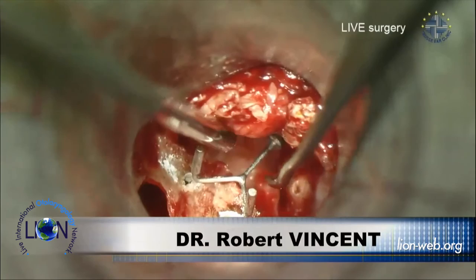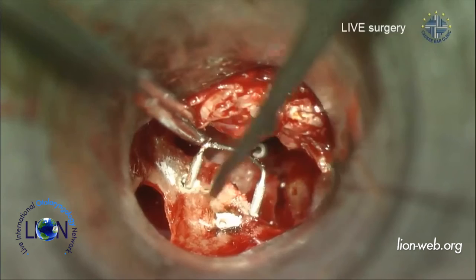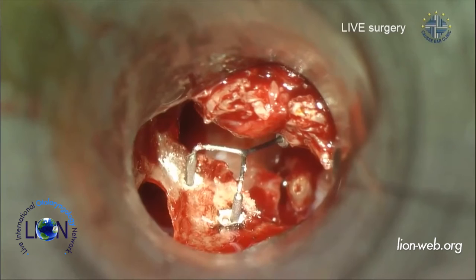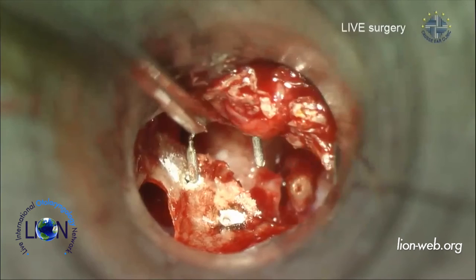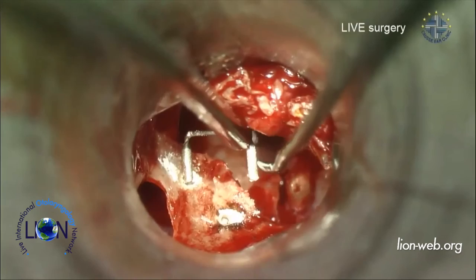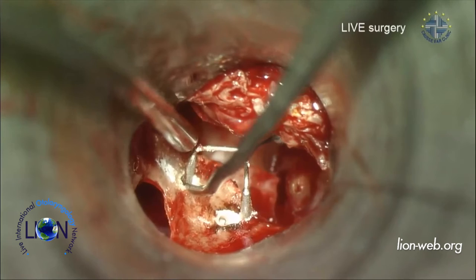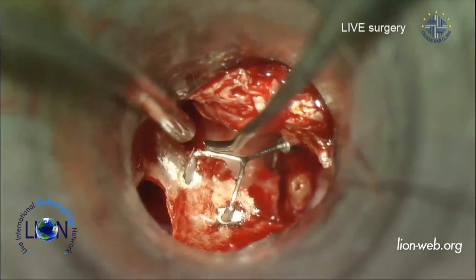Robert, have you opened one of these MRPs a year or two later? Is there any integration of these? No, I didn't see any integration, which is very surprising. I thought there would be because, of course, it's titanium. So we thought that with the bone, it would stay integrated. But not really. I didn't see it. So it's pretty strange. And even if it does osteointegrate in the future, we studied with Thomas Lenhardt's department. As I said yesterday, we fixed the MRP with cement in the temporal bone, and we studied with a laser Doppler interferometer to see if that was reducing the mobility of the prosthesis, and that was not the case. They were still vibrating. So it was really a nice study, which was very interesting for us.